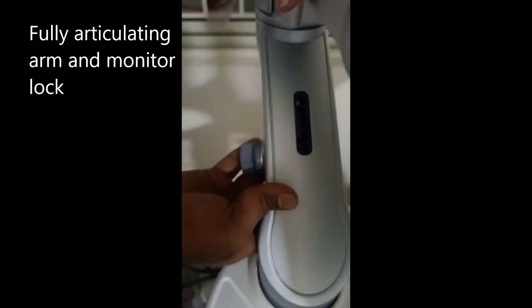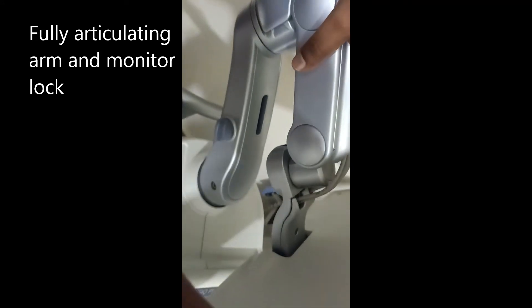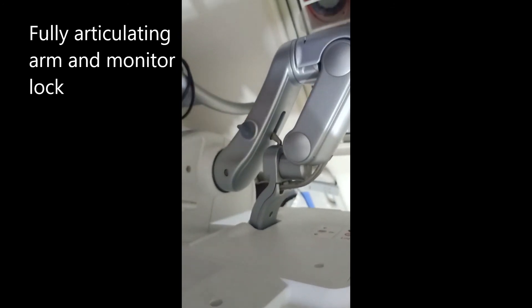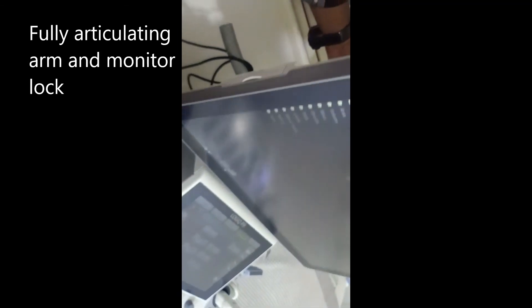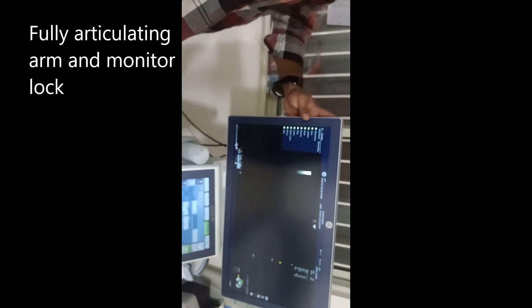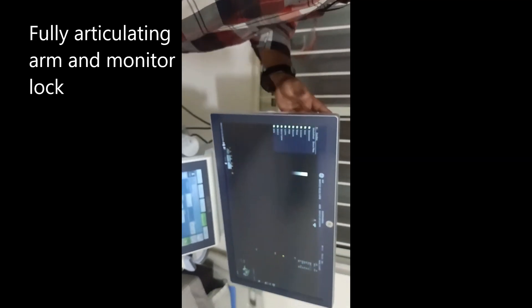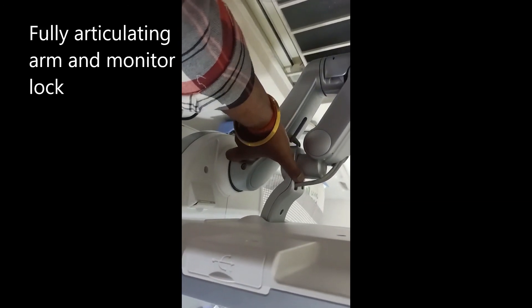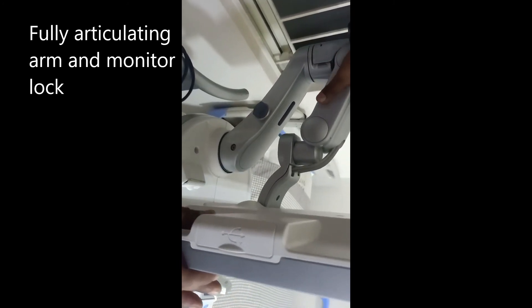This is the arm folder and monitor lock. Once it's locked, it won't roll. To move it again you have to unlock it — that's all there is to it.